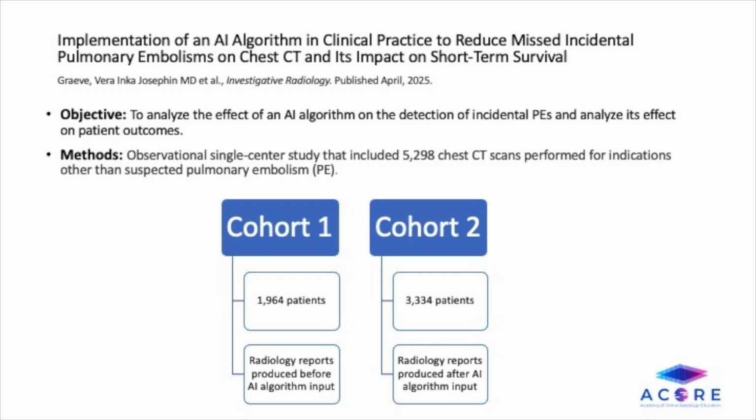For comparison, Cohort 1 was reviewed retrospectively by the AI algorithm. In both cohorts, any differences between the original radiology reports and the AI output were reviewed by two cardiothoracic radiologists.